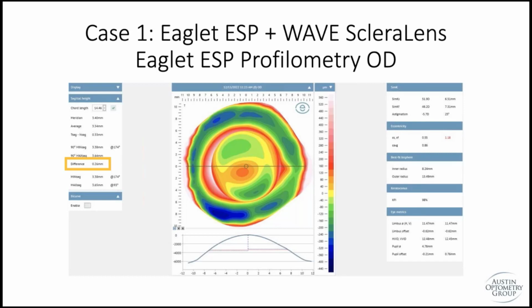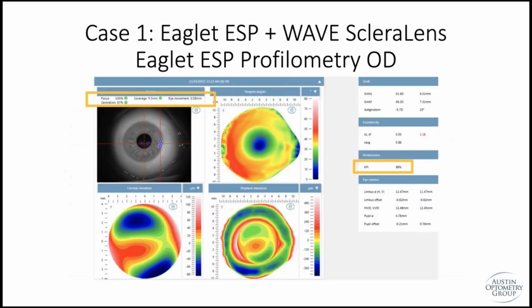It's essentially the same principle, but on the sclera, it's your main scleral meridians, 90 degrees apart from each other. Other data is obviously useful, but mainly you're going to be looking at that difference highlighted there. On the right, it's like your normal corneal topography information, and then you also have some metrics down at the bottom. So really pretty robust metrics on this main page.